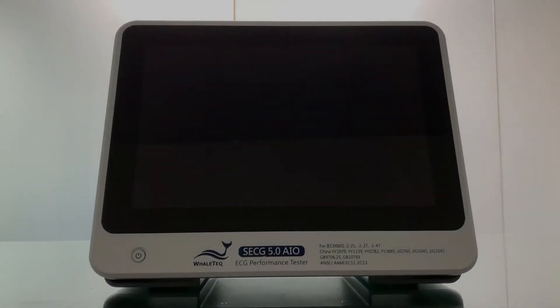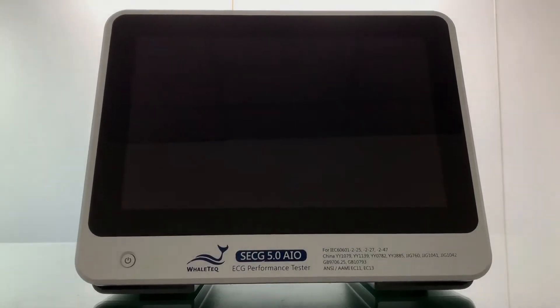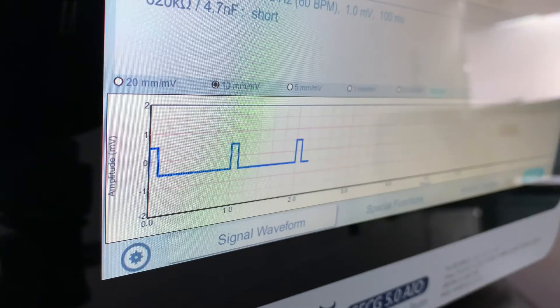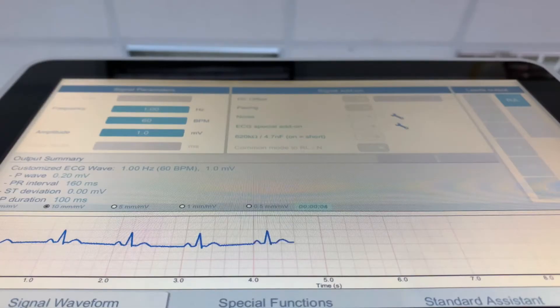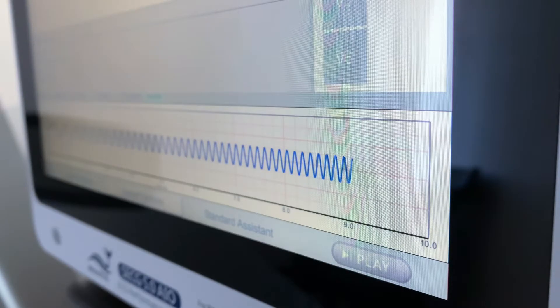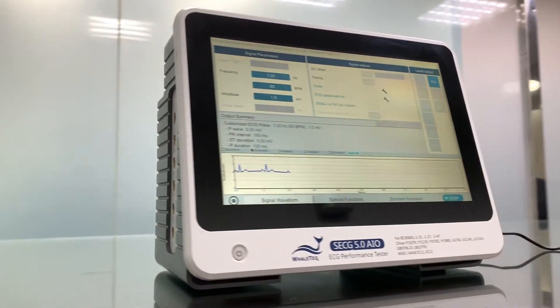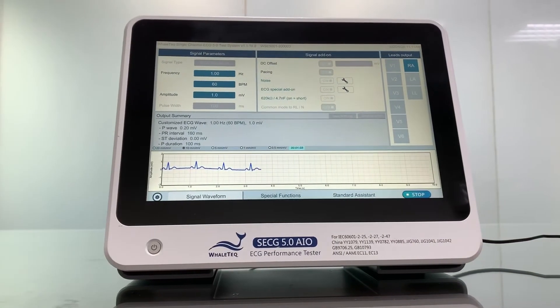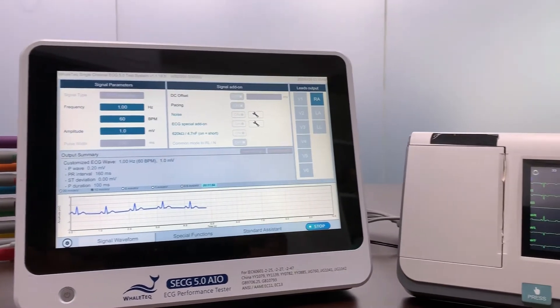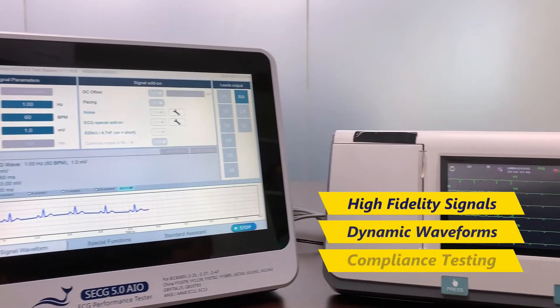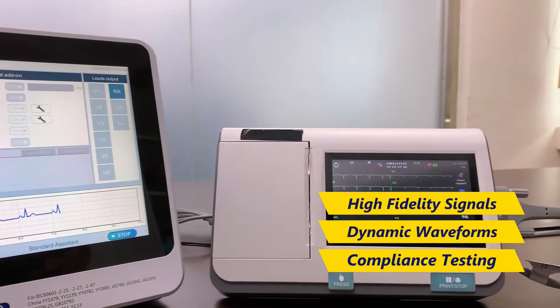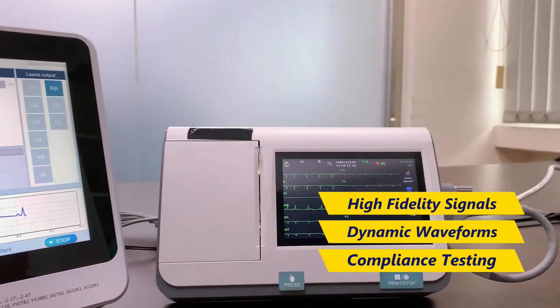WhaleTeq's SECG series has redefined what it means to be an ECG simulator for manufacturers. With the core design of generating high-fidelity signals, playing realistic and dynamic ECG waveforms, and verifying the regulatory compliance of ECGs, WhaleTeq presents SECG 5.0 — the most advanced all-in-one ECG simulator, playing accurate and realistic ECG waveforms while making standard compliance easier than ever before.